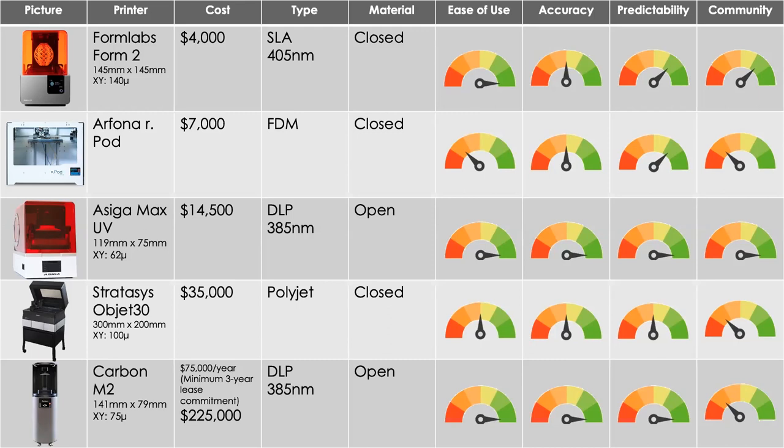And finally, you'll also see on this chart that we are mentioning open and closed systems. So what we mean there is a closed system is exactly like where companies are copying the traditional printer business model of selling you the printer at a loss in hopes of recouping that loss later by overpricing the ink. Again, finding parallels from our past mistakes, my first milling system, we had this RFID barcode reader that you had to scan the disks in, and if you didn't have a barcode, you couldn't mill it.